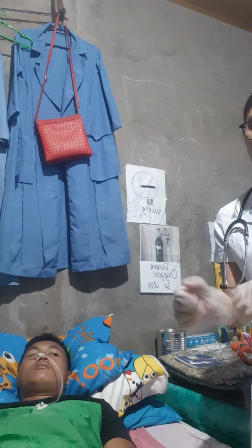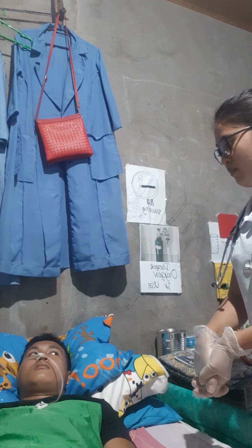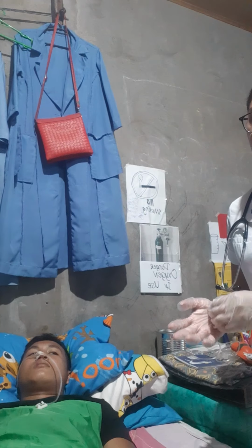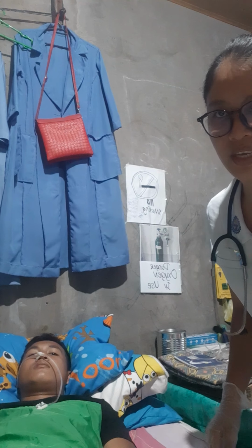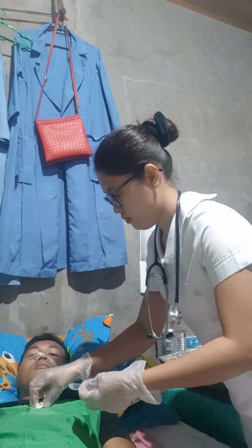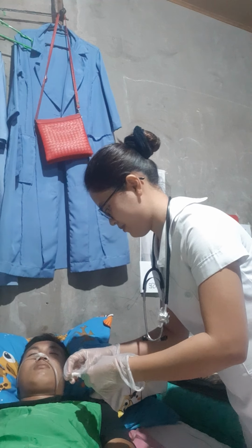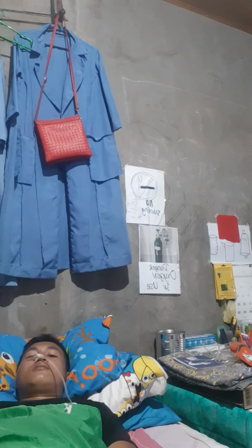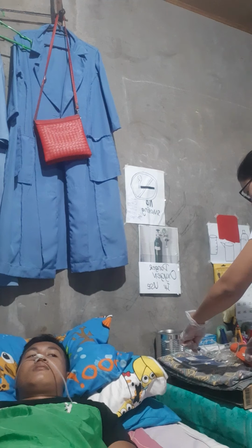Afterwards, we need to assess the tube placement. So the tubing is already attached, and we need to attach the syringe to the open end of the tubing, and aspirate to check the pH.